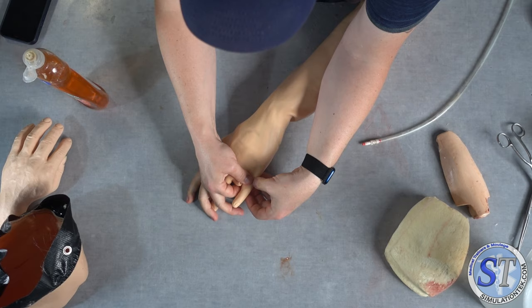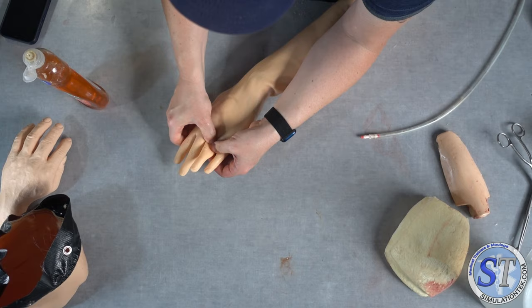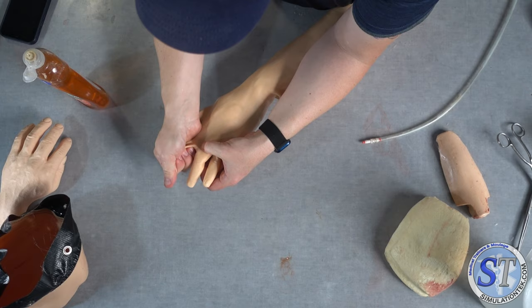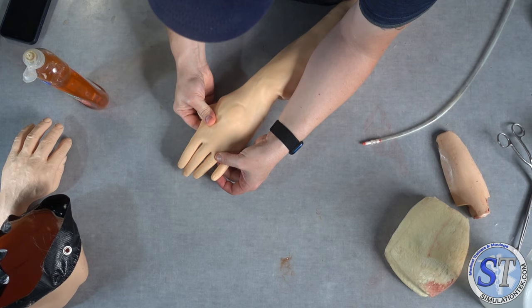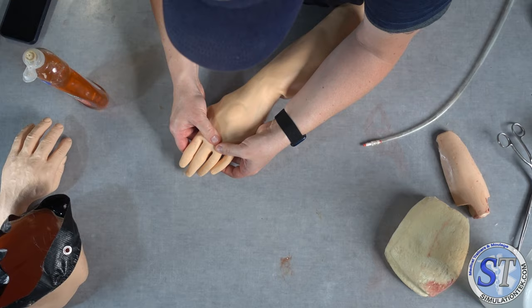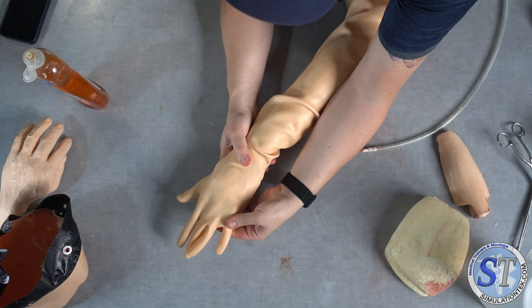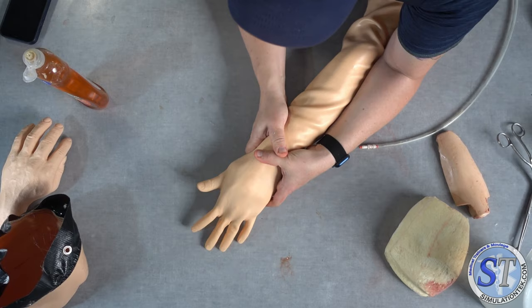So we're going to check where I am with that wrist. And there we go. So I'm getting my thumb in there. And what you want to do is once you start getting over the wrist, you want to start guiding the fingertips in where they go. You might have to back it out a little bit, like I think I'm going to have to right here. Or you might get lucky like I just did.